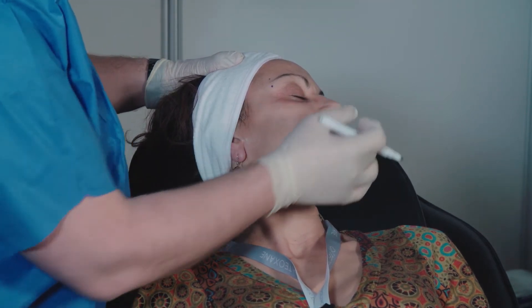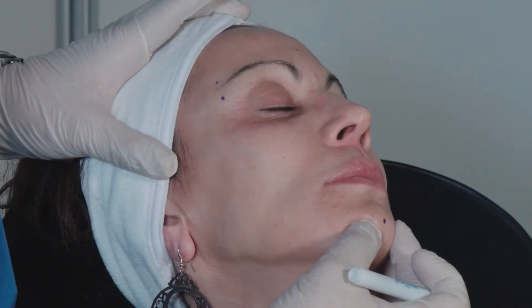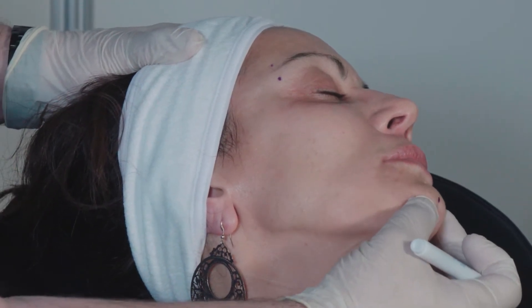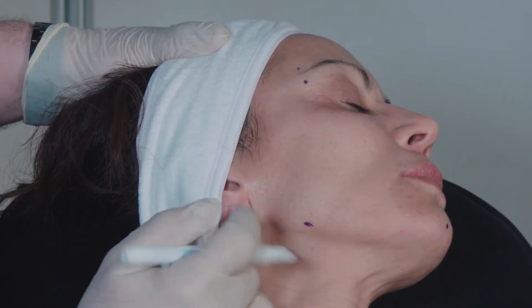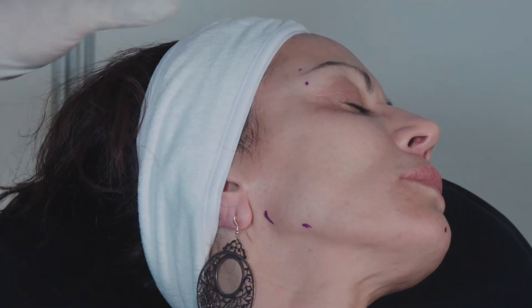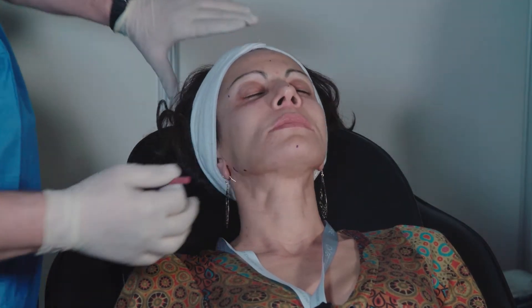To correct this profile, and then for the lower face, we will inject the mentalis area — the chin area — to project the profile. She also has a little depression there and I want to improve the angle. So we will inject the lower face. And then I want to show you very quickly the danger zones.